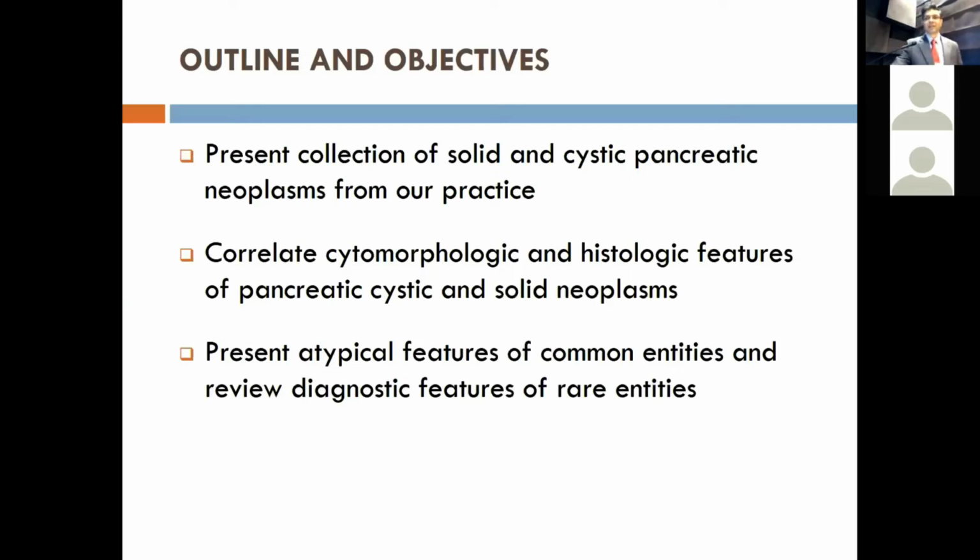Good morning, everybody. So my presentation today is basically case-based, and what I'm going to show you is a collection of cases that we have seen in our practice over the years that include both solid and cystic pancreatic neoplasms. Some of these entities are rare, but showed very classical features. Other cases are more common neoplasms, but they presented with atypical morphological or clinical picture.